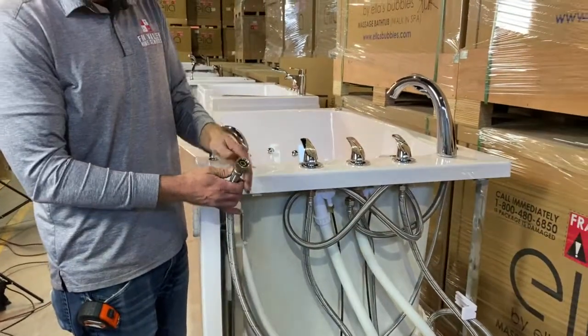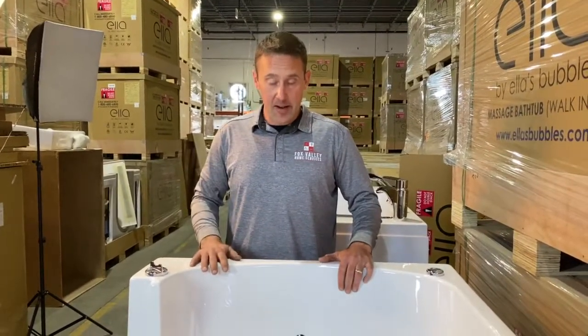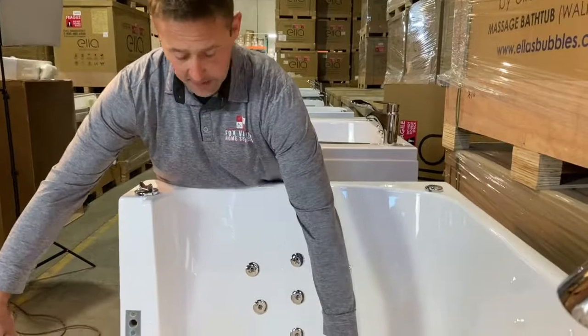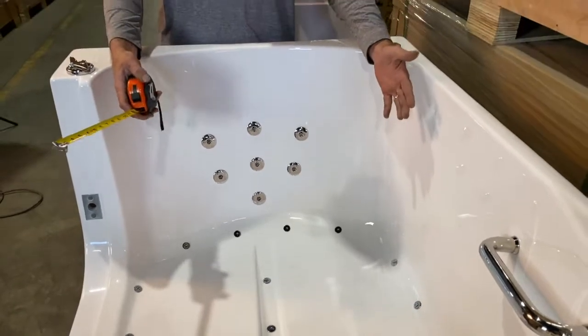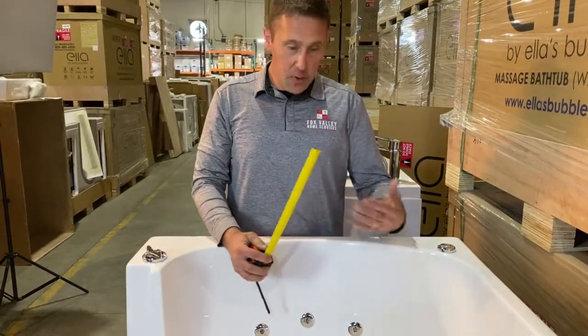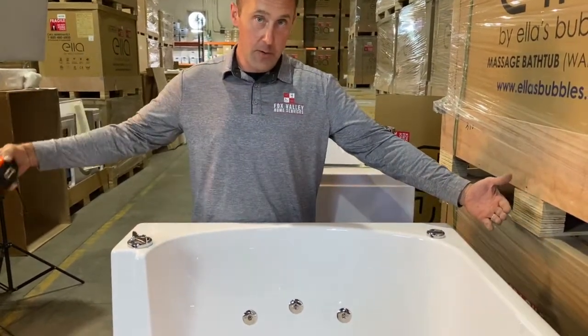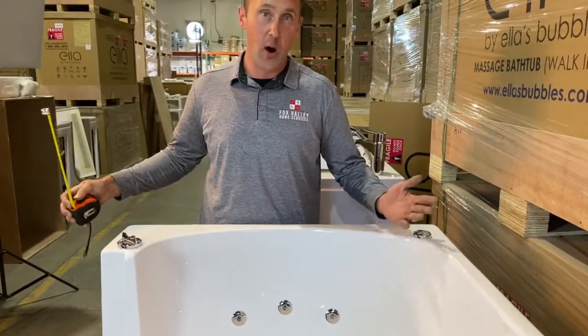Another thing that makes our Transfer Series Walk-in Bathtubs unique is the wide variety of selection we offer. This is our Transfer XXXL — this particular model is a full 36 inches wide. The seat itself is a full 28 inches wide, which is wide enough that we could fit many of our competitors' bathtubs right inside this tub. The beauty of our Transfer Series is that we go all the way from a 26-inch wide model up to a 36-inch model, so we have a Transfer Bathtub for every space and every bather.